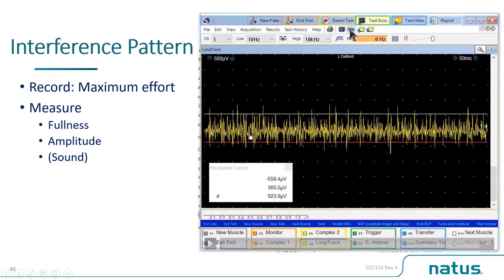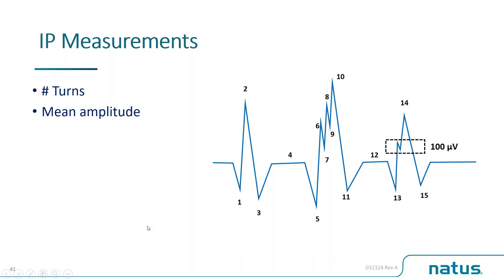And this analysis can be very useful, particularly in patients with myopathy. If the muscle is weak and wasted, and you get a full pattern with low amplitude, that is specific of myopathy. But again, it requires patient cooperation, and many people cannot give you maximal contraction. So there are other methods of quantitative analysis that can be used even at lower force of contraction.